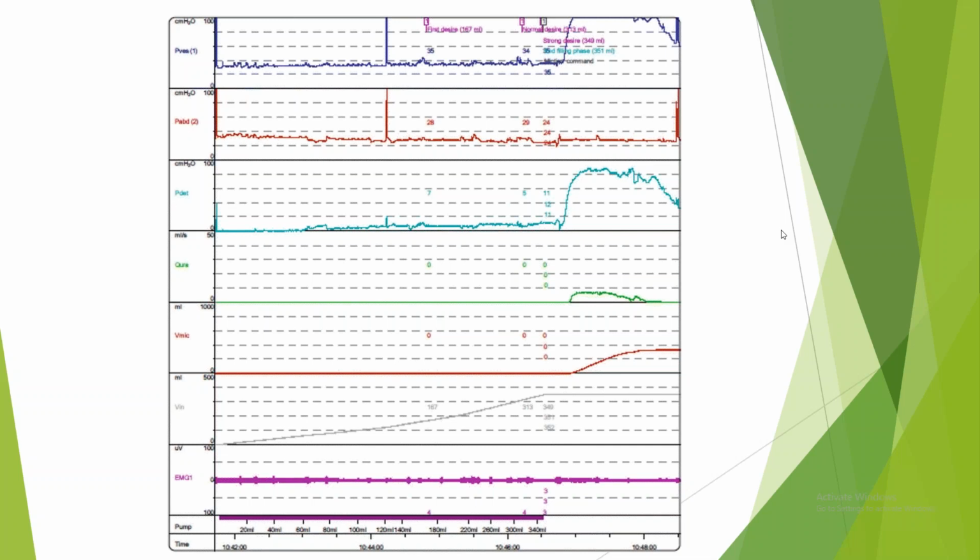Doctor, why reduced bladder capacity? Can you explain, please? Strong desire to void is at 350 ml, 349. It should be 400 to 600. Yes. Even the voided volume, when she has 350 ml, is around 150 only.